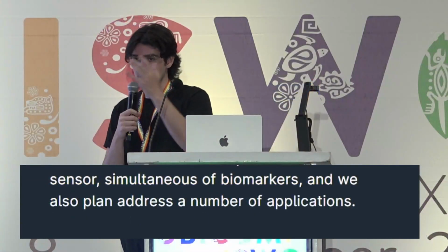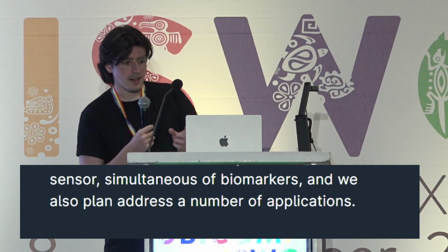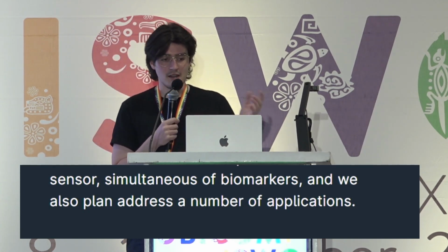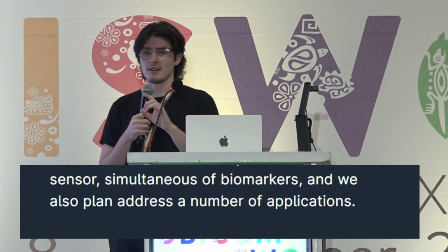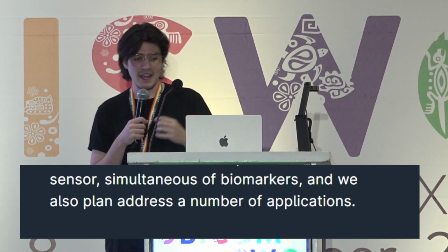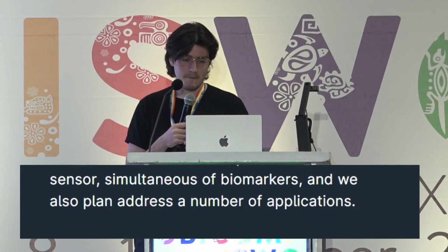And so what we do is we actually replicate that exact same process using a smartphone. So we model a thermometer using a smartphone, just bringing it in contact with the user's body and measuring the rate of heat change across the interaction, and then learn empirically this transfer function to estimate core body temperature.